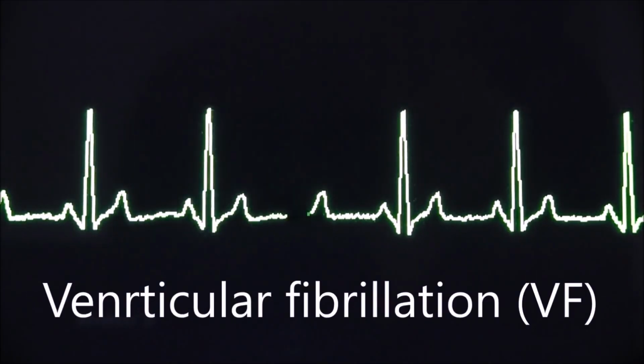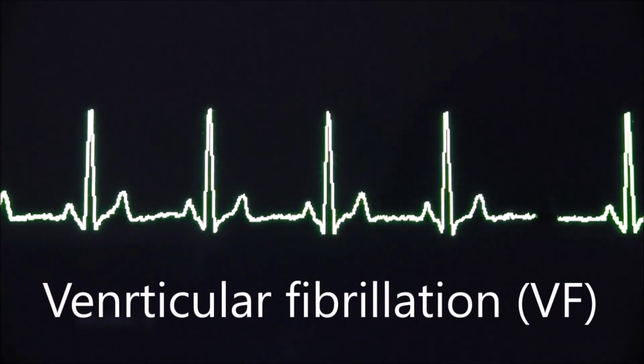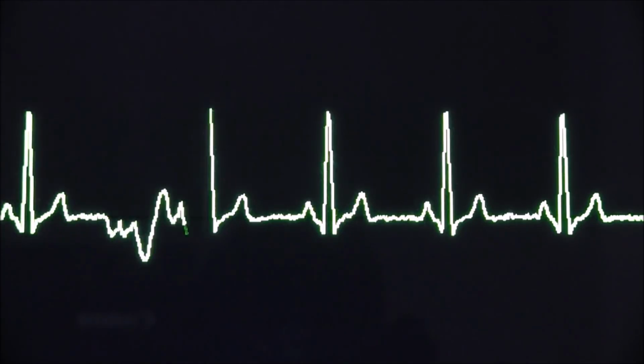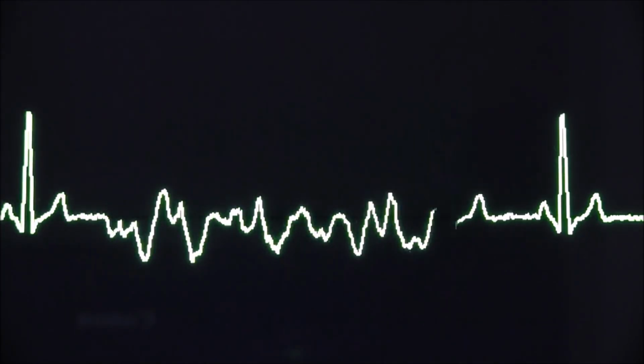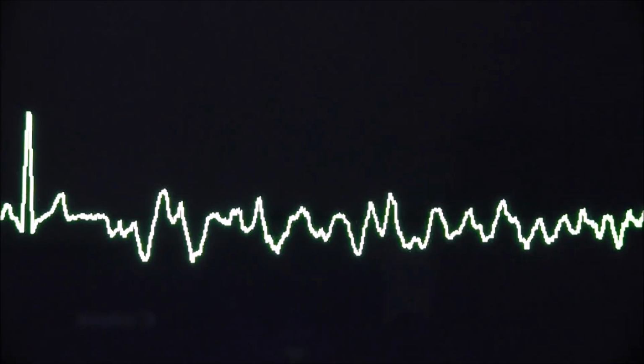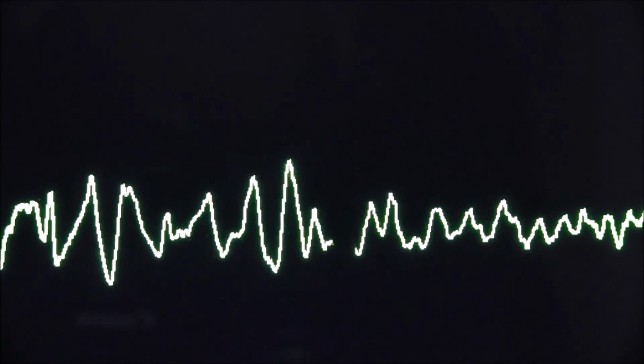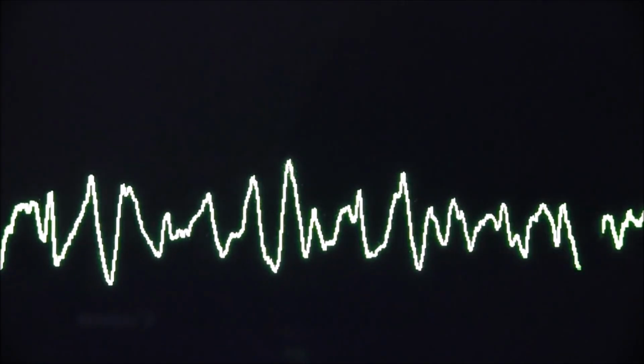So this patient's in sinus rhythm at the moment. Let's just keep an eye on it there. Now the patient's now gone into ventricular fibrillation. And in ventricular fibrillation there's fast, the machine's alarming to tell me, that's good, I had noticed.